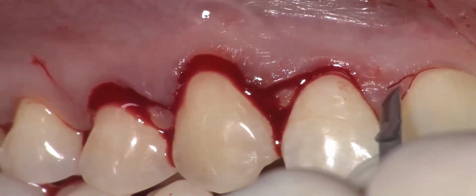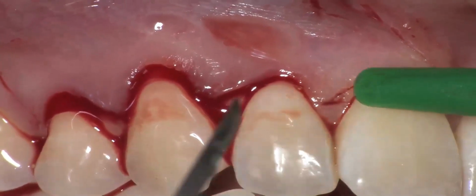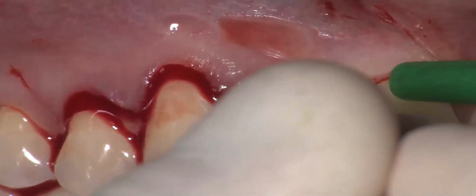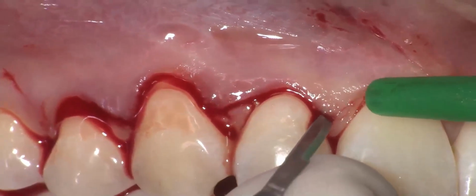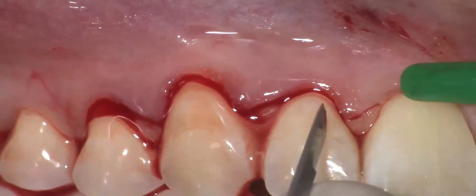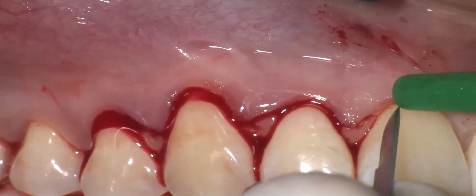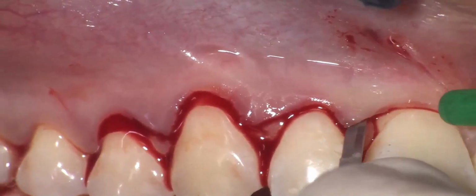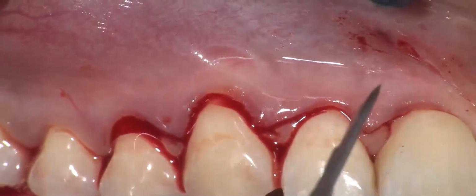Now I'm going to prepare another triangular shape. Very careful in giving a good thickness, epithelium and connective tissue thickness, to the tip of the triangular shaped papilla.